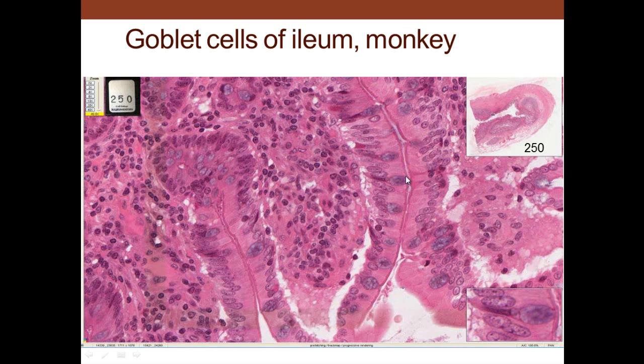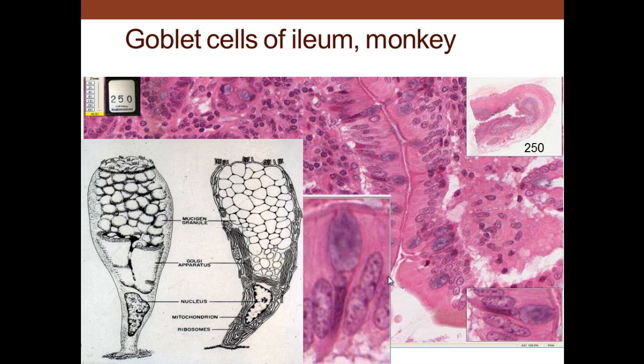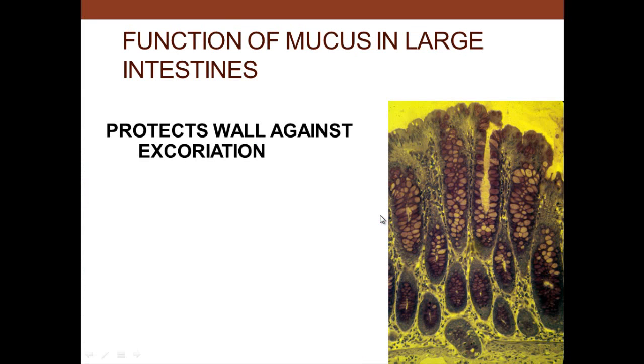Here we see the goblet cells here, intestinal absorptive cells, brush border, as we see of those cells. So we can see them. The nucleus is kind of thin in through there and dark. That's what we see in all through there. And then the theca portion being discharged right out through there. And here we see some terminal bars between adjacent cells.